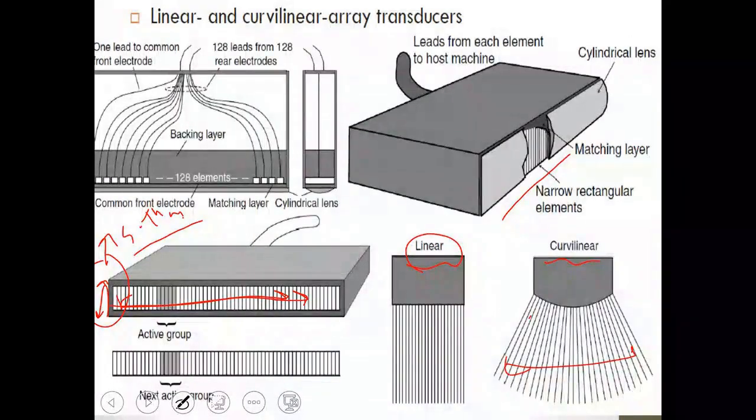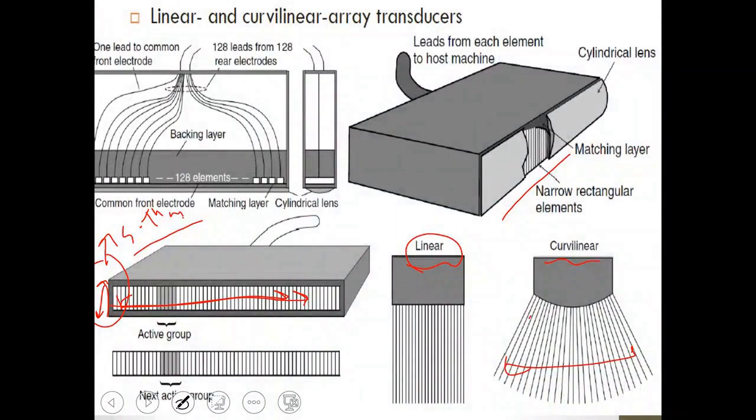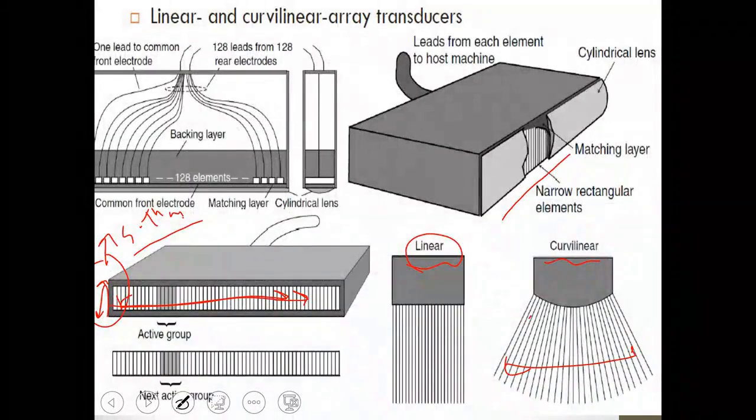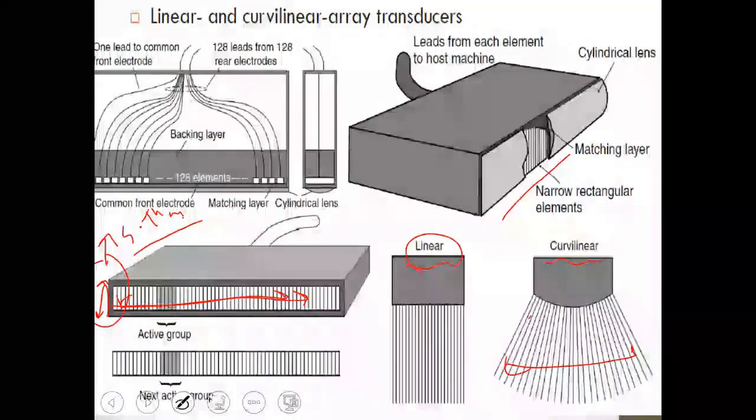Each element is connected by a wire, and this wire gives you an electrical signal or electrical shock that creates the vibration for the piezoelectric material.